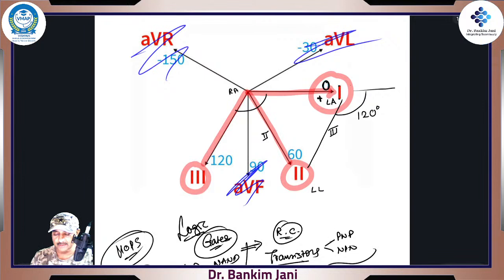This 2 is at 60 degrees. Yes, that also makes sense, right? But 3 was here, but from 3, it was shifted over here because it is at 120 degrees with this baseline. So that's why now we have got three systems, three angles, right? One, this is extreme left. From left, we are watching. This is as if we are watching from below. Here also, we are watching from below, but from a different side.